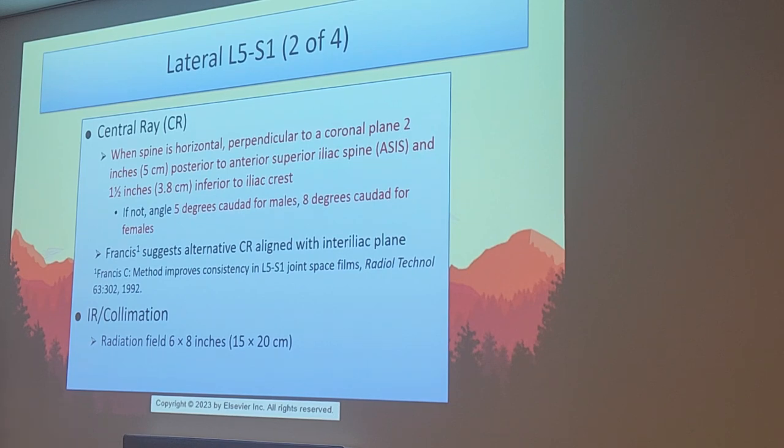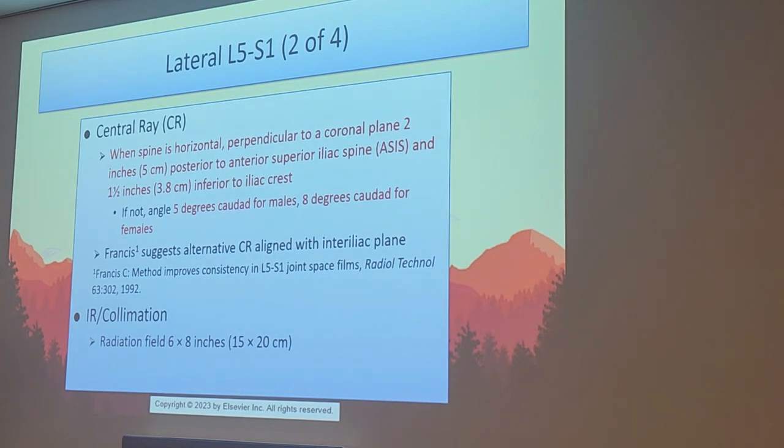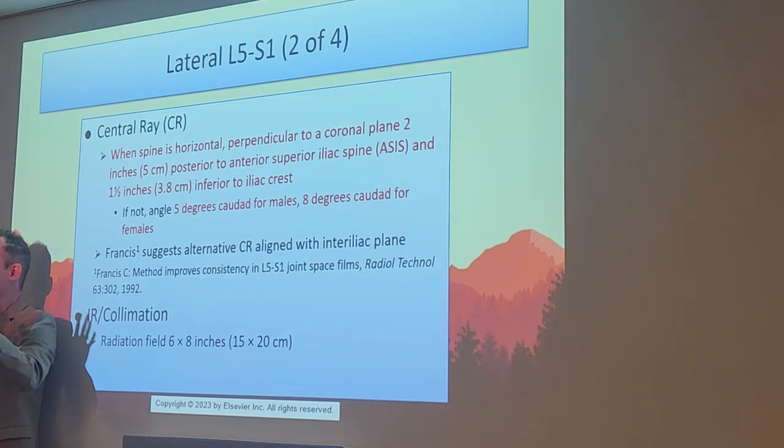But anyway, let's talk about the centering here real quick, guys. Now, when the spine's horizontal, only when the spine's built up, by the way, we're going to use a perpendicular central ray. The centering point is going to be 2 inches posterior to the anterior iliac spine, and 1.5 inches inferior to the iliac crest. Now, did we learn this in lab the same way? That's kind of confusing, right? I'm going to show you all in a second a way to nail that centering every time.